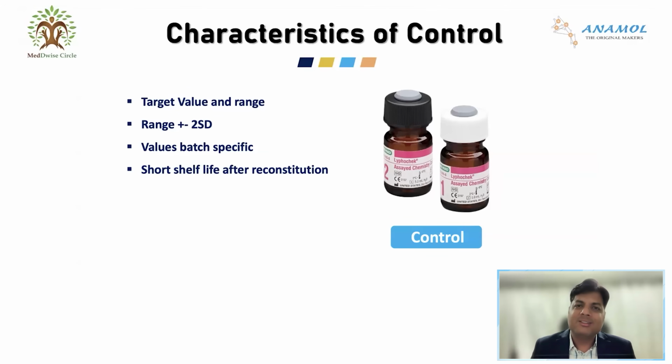We also have to understand that if the controls are available in lyophilized form, that means in powder form, and when we add distilled water into the powder and convert this powder into a liquid, then every parameter or every analyte has a particular shelf life.